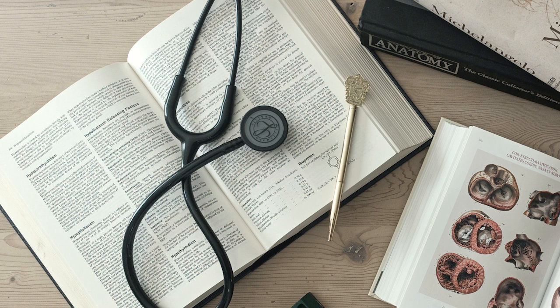Exactly. It's like trying to fire a gun before it's fully reloaded. Understanding these two periods, absolute and relative, is key to explaining the varied and sometimes bizarre ECG appearances of premature beats. Let's apply this to atrial premature contractions, or APCs, also called PACs sometimes. What do they look like on the ECG, and how do those refractory periods influence their appearance?